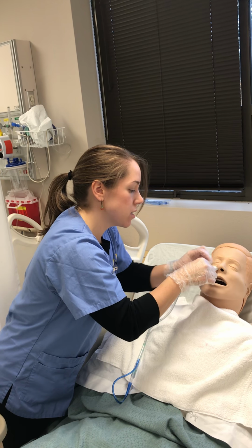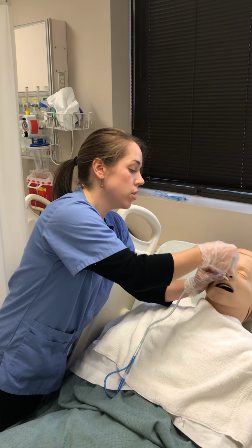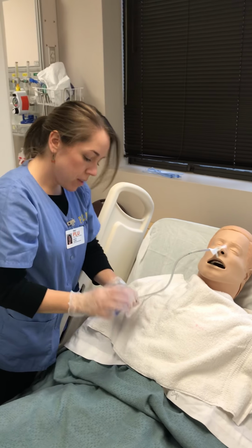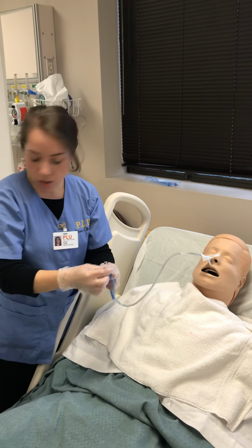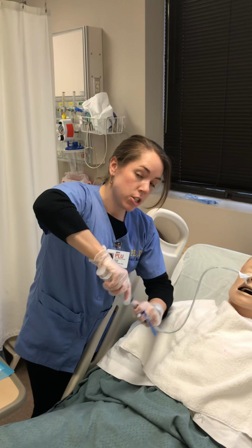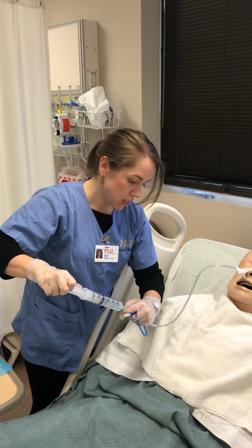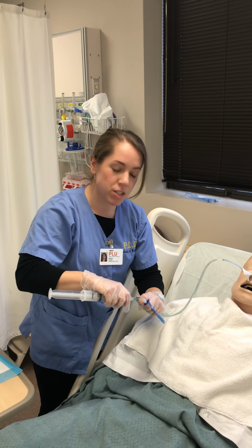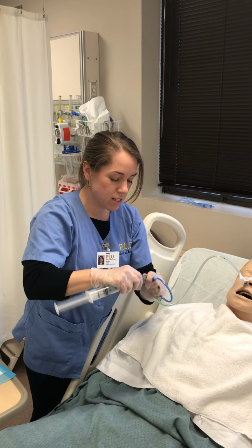Okay. And once I get to the marked point, I'm going to tape the tube to the nose. And then once I'm there, I'm going to make sure I'm in the stomach. And I'll do that by pulling out gastric fluids, and I should see some green fluid come out. And I'm getting a little bit here. So I just need a little bit, so what I'm going to do is I'm going to be really careful and remember gravity is my friend and remove this.